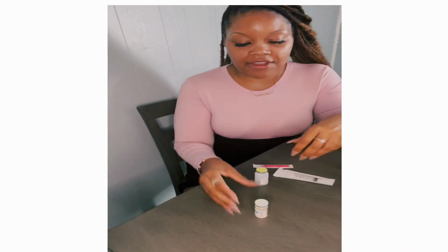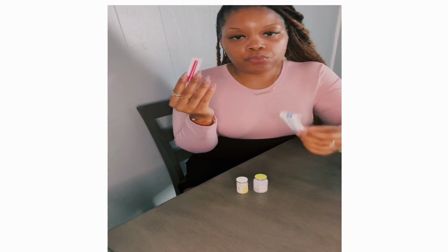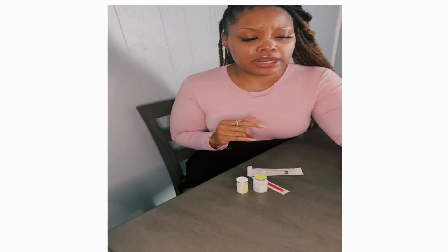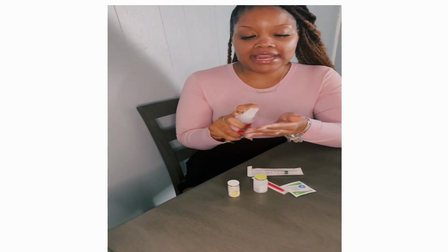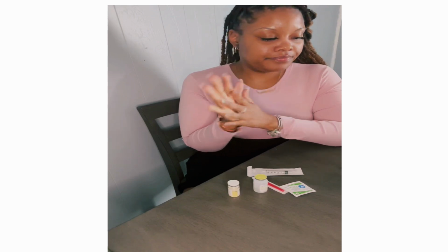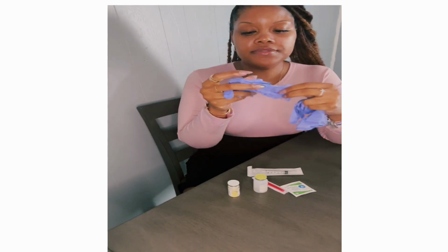Does that make sense? So you want to make sure that you're choosing the appropriate syringe. All right, so we have our medication, we have our sterile water, we have our needle, and we have our syringe. So we want to bring an alcohol pad. You want to go ahead and perform hand hygiene. And then we want to put on our gloves.